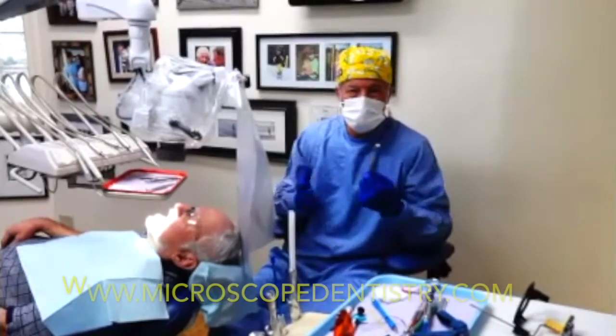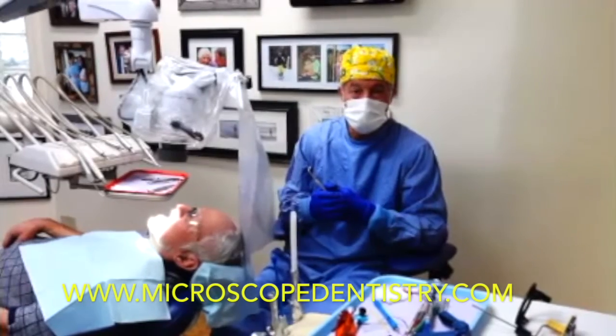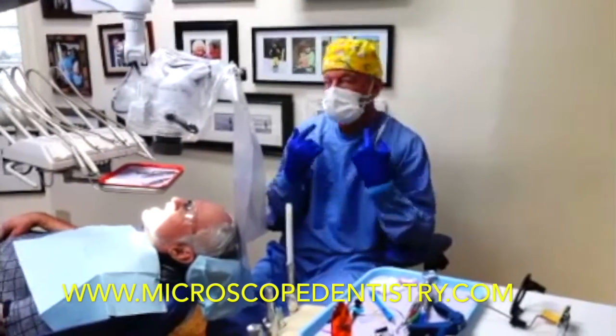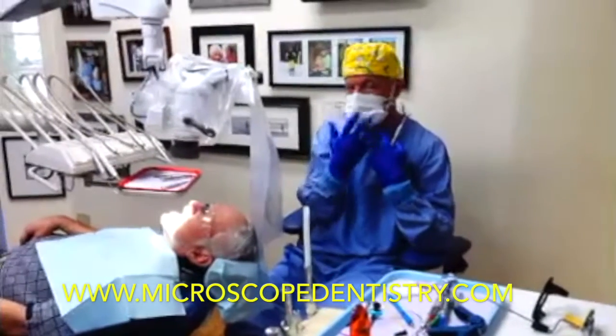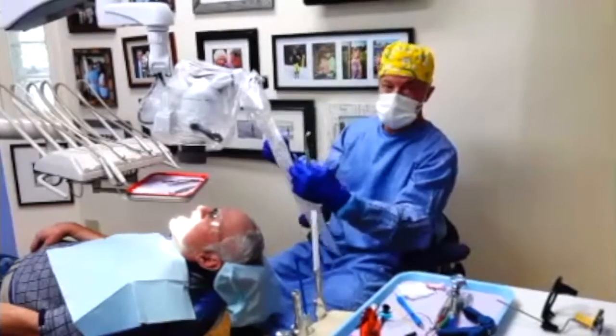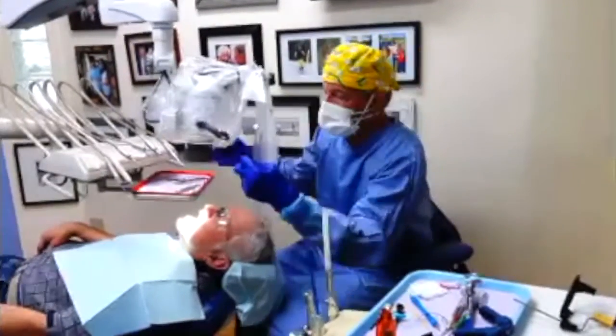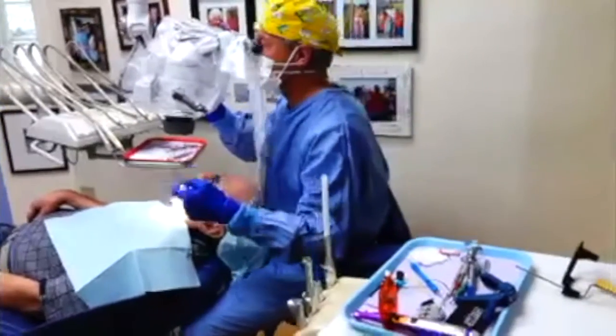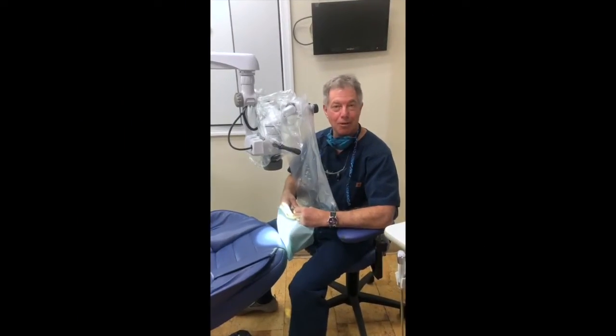And now we see us all kitted up with a cuffed gown, an N95 mask underneath, a regular disposable mask, we've got a microscope bag, and another drop barrier on top to keep between patient and operator. I hope this is helpful to you.